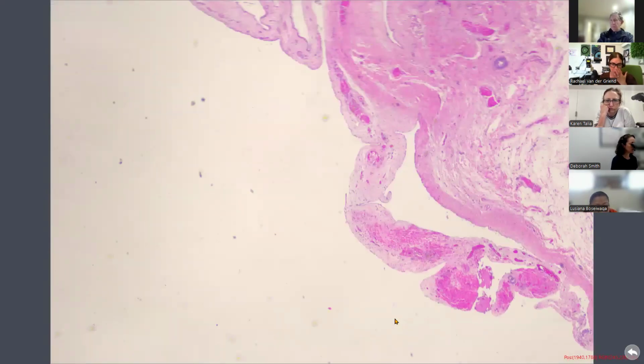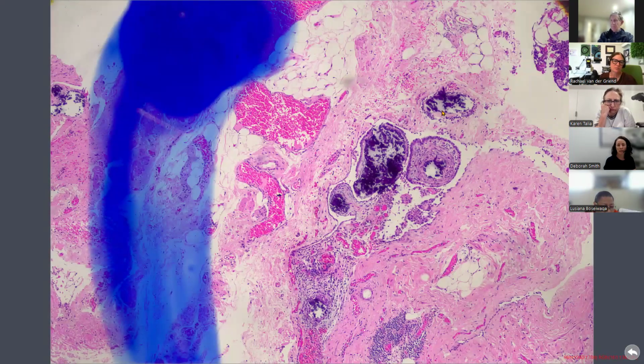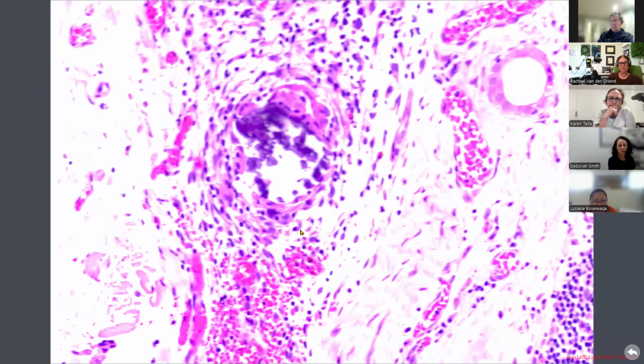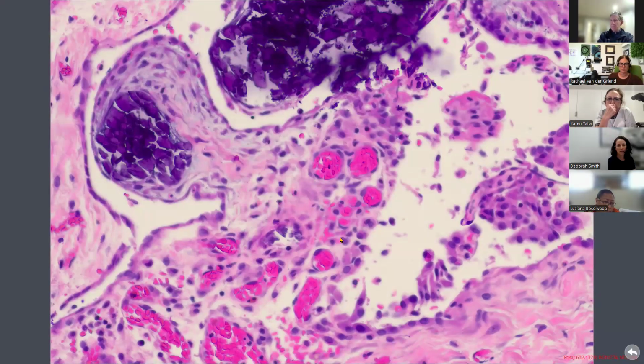And then subsequently, we also found similar small things elsewhere in the omentum. So here we are. This is her peritoneal omentum section, I'm not sure. But elsewhere in the abdomen, again, mesothelium coming around through here, granulation tissue type stroma. We look up closer at that. It's a bit hard to see where the epithelium is sitting here because you've also got inflammatory response, so it bleeds into the stroma. That's quite classical for implants. And again, sitting up the top here.